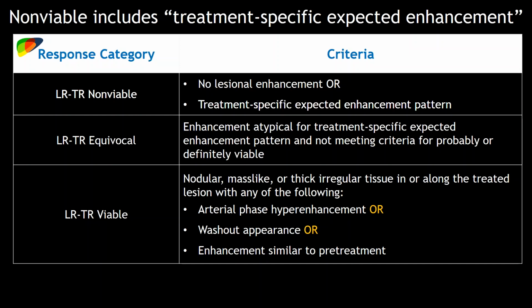You would say, by strict application of the LI-RADS treatment response algorithm, this is equivocal, but in this particular case, I am very concerned because it looks like the inner enhancement is quite mass-like, and even though it's equivocal, I would want to discuss in multidisciplinary conference, and in that conference I might advocate for retreatment, even though the LI-RADS response is equivocal. So I just want to congratulate whoever it was who brought up that point. I thought that was a very astute point.